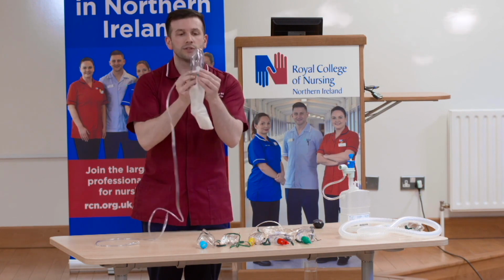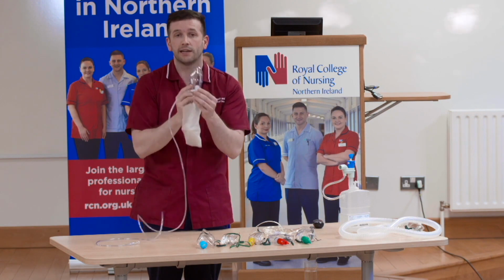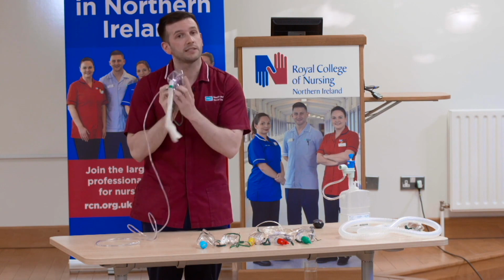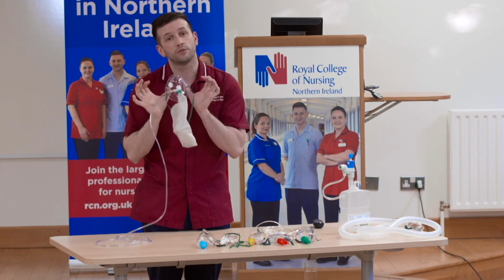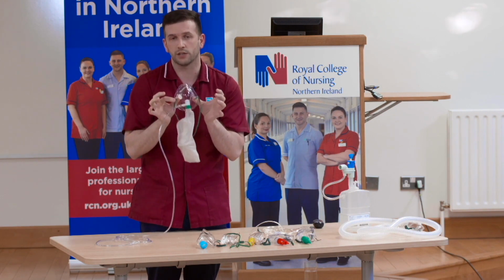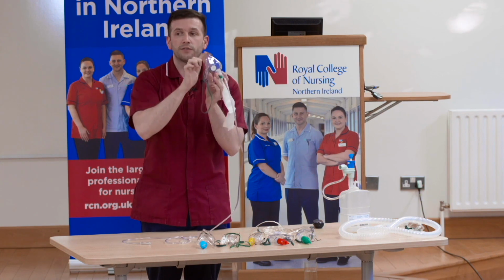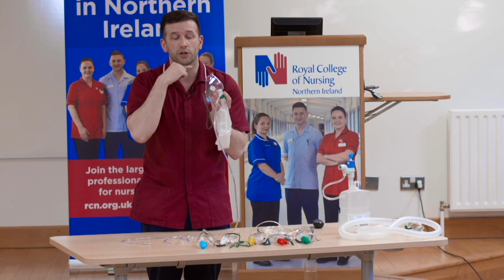You will always notice on these masks that only one valve will be present on the side, and the reason for that is safety. If both sides had a valve on it and there was some kind of gas failure, it can increase the risk of doing harm to your patients and suffocation. The interface, as designed, will sit over the bridge of the nose and usually here in the cleft of the chin or just under the chin.